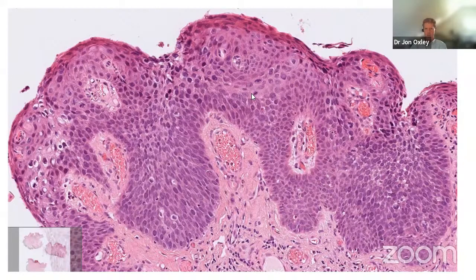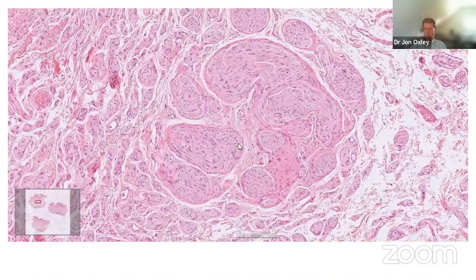Lack of maturation, mitosis going up, clearly dysplastic. And also in the background, there's lots of nerves in the foreskin. And someone commented on this, but this is probably a normal anatomical appearance. You often get these little twiglets of nerves in the foreskin, so that's probably normal.